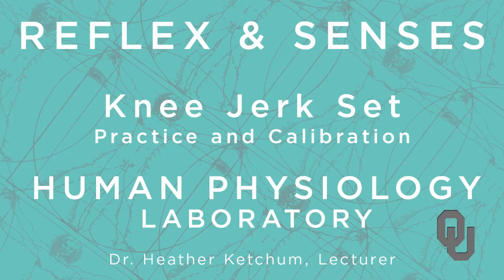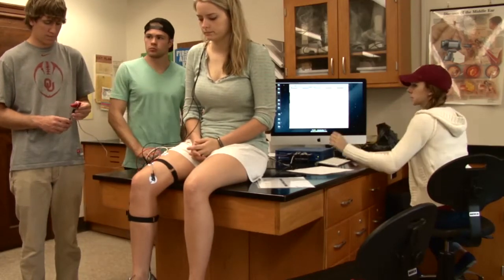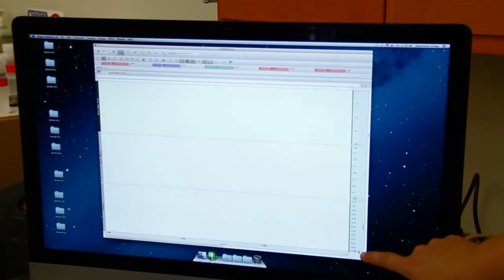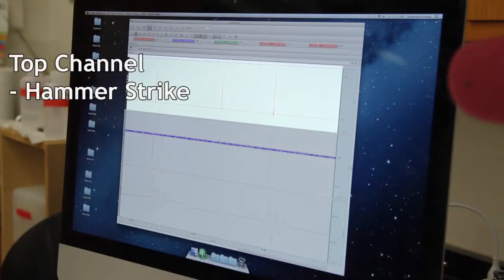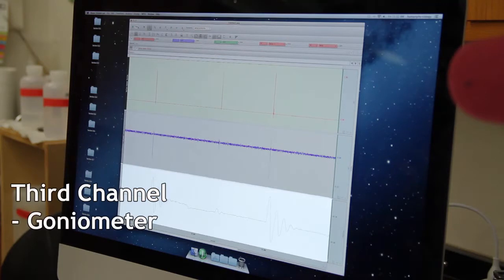Now we're ready to begin the controls, but before we start we need to calibrate. If you go down to the screen you have three channels. The top channel is your hammer strike, and if you look on the y-axis it tells you what is hooked in. The second channel is your EMG and the third channel is your goniometer.